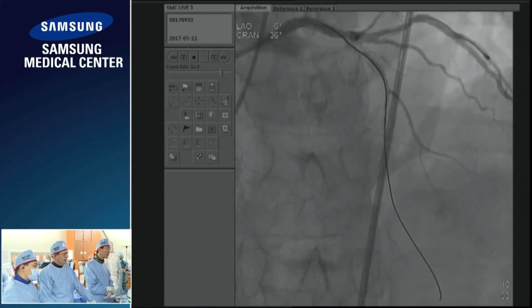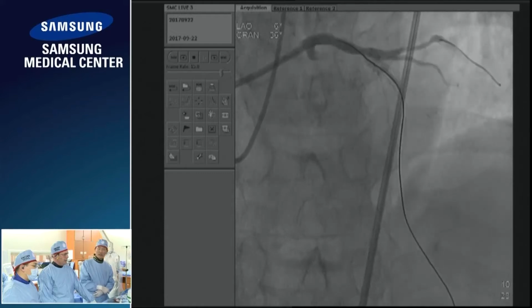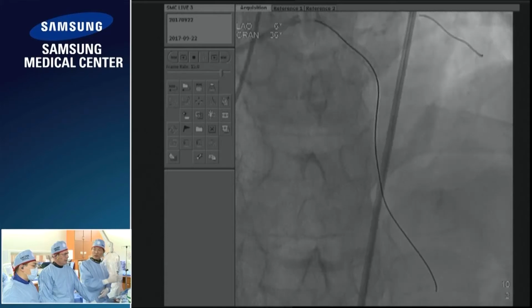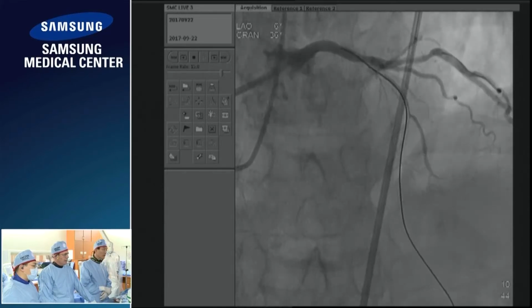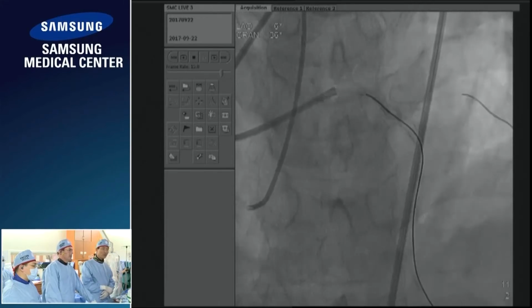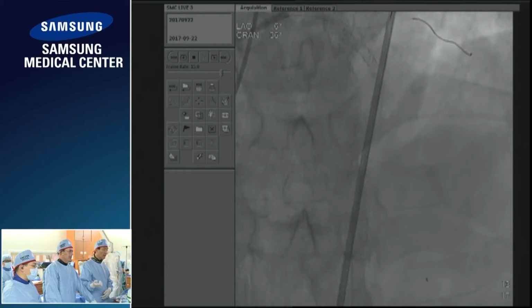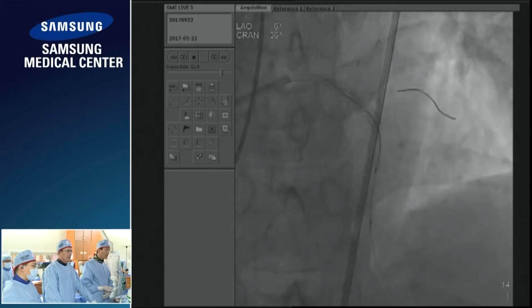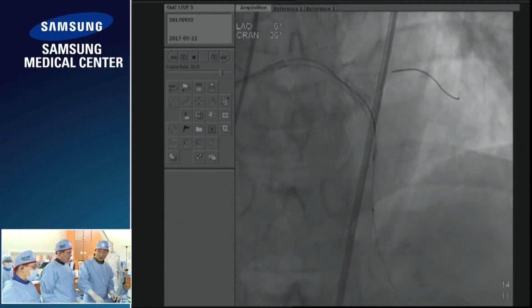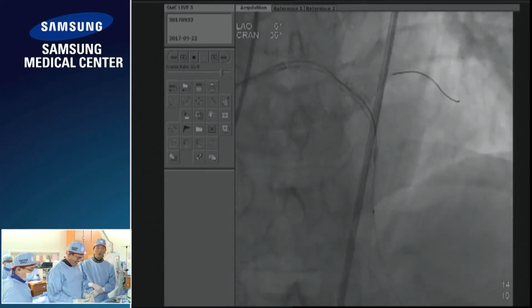You can see the target lesion is very short, but still in the distal half of the stent there is a lot of plaque. The stent restenosis is maybe present, it was 3 months earlier than this procedure. So next, and we did a 1.5 balloon, 14 atmospheres. Next. And changing next to a soft wire. And we did the IVUS. But this is where we are now. Dr. Hill insists that we need an OCT to understand more.